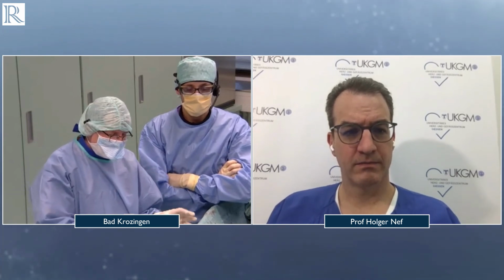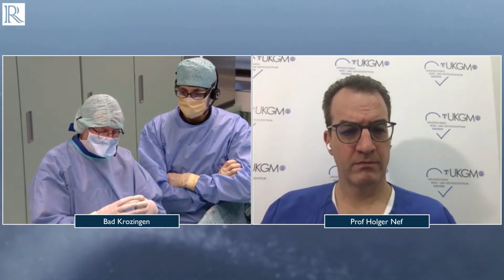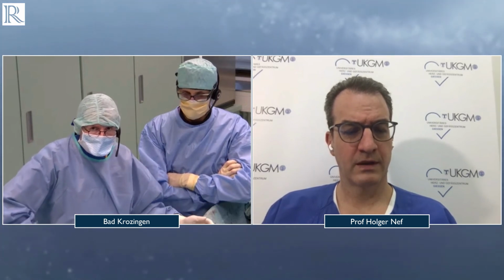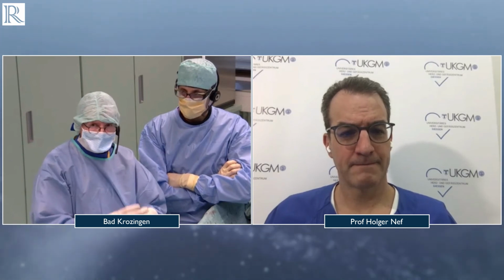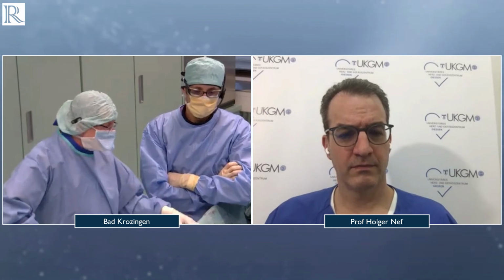I think if you have a concentric lesion with a diameter below 2.0, lesion preparation with balloon or rotablator is a first step. And if you have imaging information, okay, there is enough lumen diameter, so you could even go directly with the IVL catheter to the lesion and give shocks.